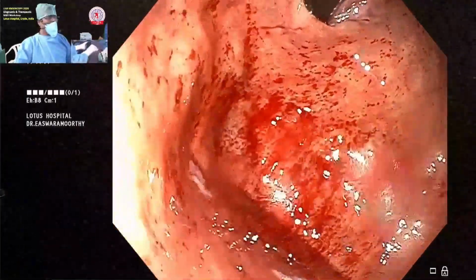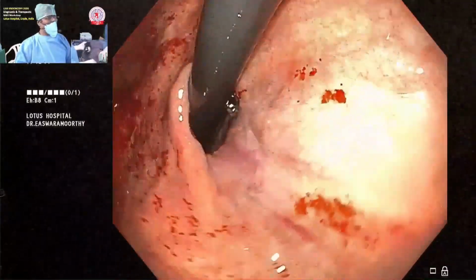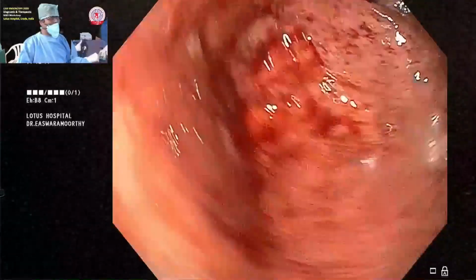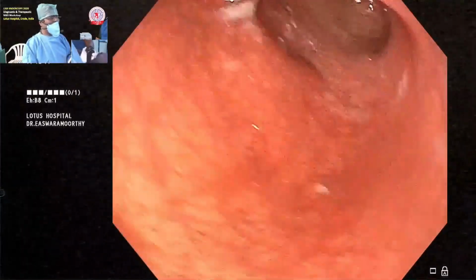This repeated oozing is a cause for chronic anemia. So that is one thing. We can reduce his portal pressure by giving him some beta blocker, but he has no fundal varices. That is the most important thing you have to understand. Then you again correct yourself. And the last thing we do is a distensibility test.